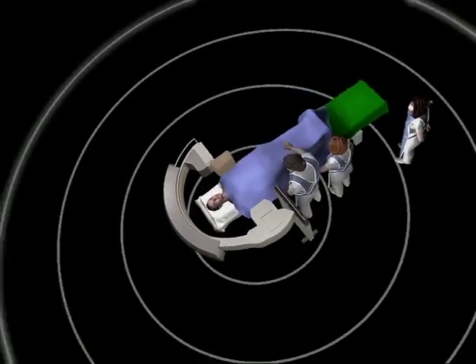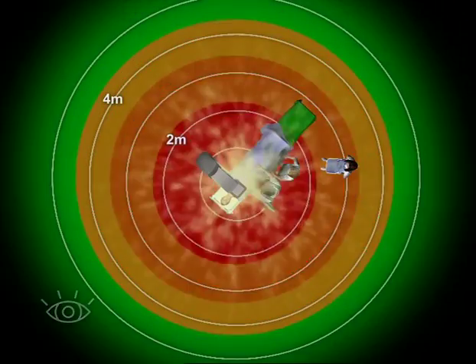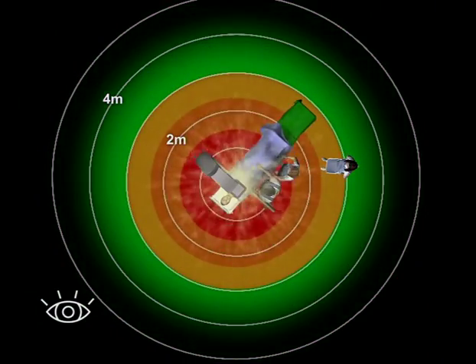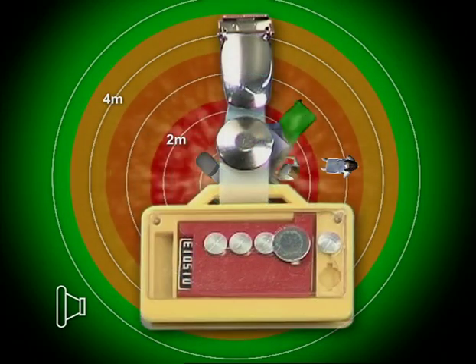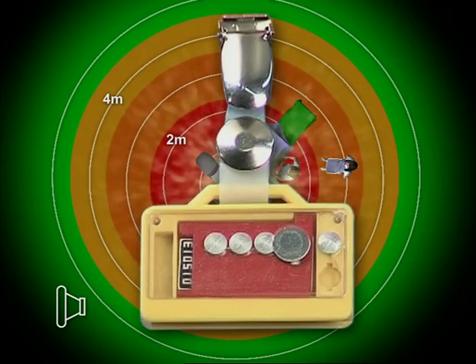In the case of lateral examinations, the X-rayed volumes are larger, with the result that the scattered radiation intensity is higher. In radiographic series, the scattered radiation intensity is significantly higher than with fluoroscopy. Radiation exposure in attending medical personnel is recorded during examinations by various dosimeters. These dosimeters are regularly evaluated by the dosimetry service.